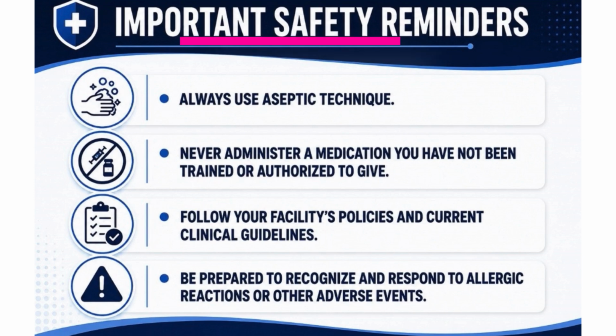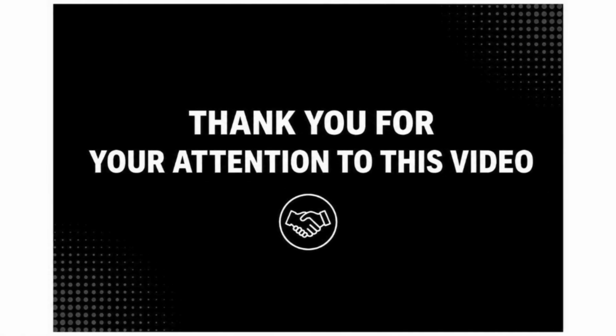Important safety reminders: always use aseptic techniques. Never administer a medication you haven't been trained on or authorized to do so. Always follow your facility policies and be prepared to recognize allergic reactions and adverse reactions.